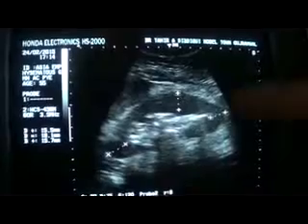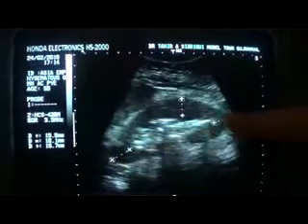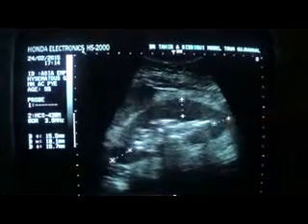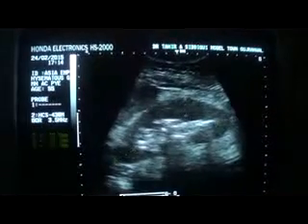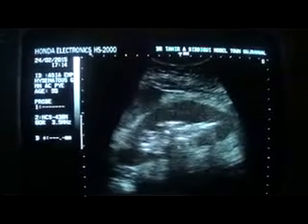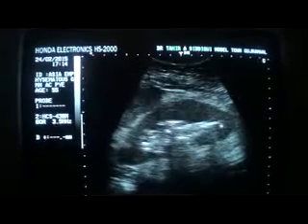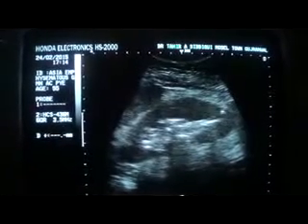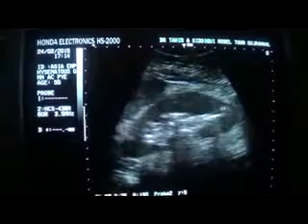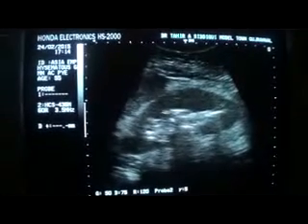At the upper pole, this one is 18.1 mm, and at the lower pole it's 15.7. So the echogenicity is diffusely decreased. This is the decreased echogenicity of the renal parenchyma of the left kidney, and the parenchymal thickness is normal. The pyramids are seen. Corticomedullary differentiation is intact.